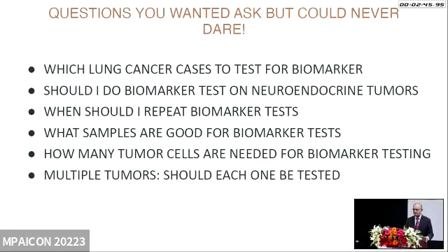Questions that I thought would be interesting: which lung cancer cases to test for biomarkers? We test all non-small cell lung cancers, whether it's adeno or large cell or NOS. An important scenario that I come across is whether neuroendocrine tumors should be tested. At our place, we test large cell neuroendocrine carcinomas routinely for biomarkers, and small cell lung carcinomas in specific scenarios, if the patient is young, Asian, female, and a never smoker.